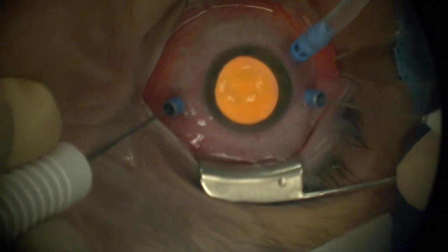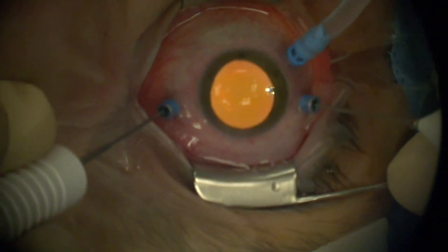All righty, thank you. So we've got the light pipe in the eye and the vitrector, and we're using an EyeMaterials wide field visualizing system. Nice to work through a wide field device. We're gonna get that focused real well, get ourselves comfortable. We're just going to take out this wrinkle in the back. We're just doing the retina work.